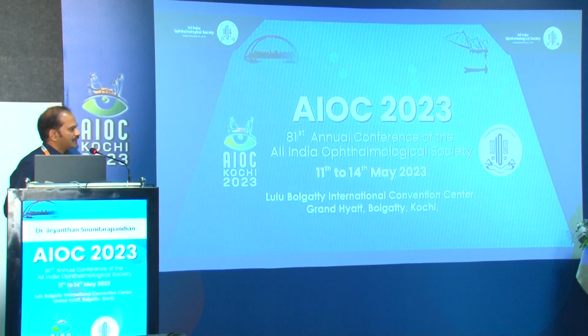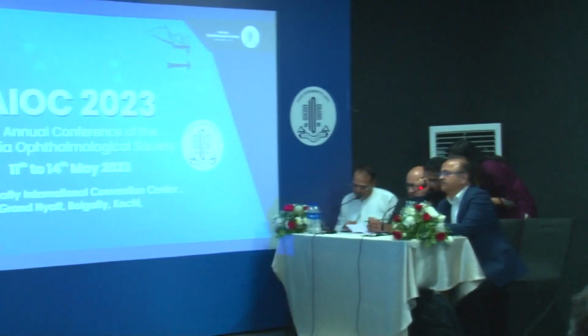Thank you so much. How much do you rely on the machine for calculation of the IOL power? Sir, usually we do both optical and immersion. Whenever there is agreement between both results, we directly go with it, sir. Do you go for any record of the old refraction of the patient, because the expectations are very high?